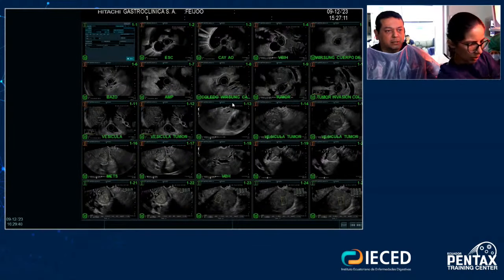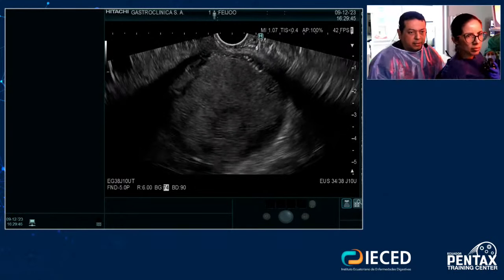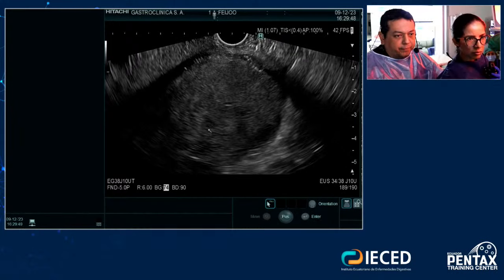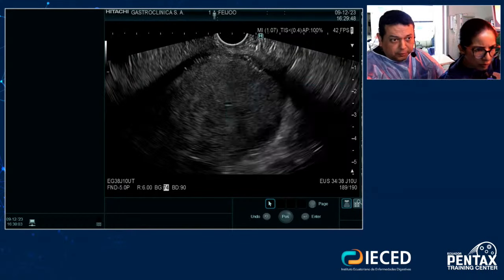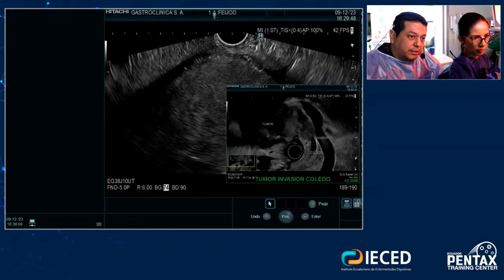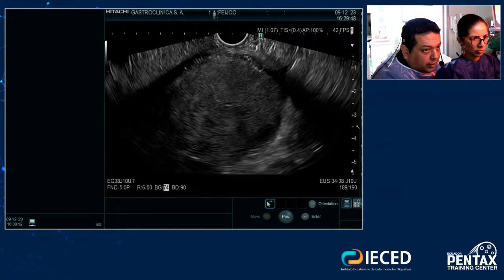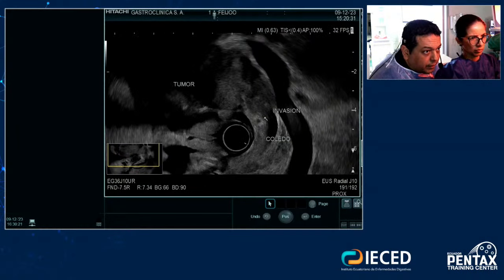And we will show you the radial image. I can show you the US image. So this patient unfortunately also has liver metastasis. Here, this is the biliary tract. You see here the tumor, very clear, very nice. Very nice explanation by Raquel. I will click to see the image bigger.